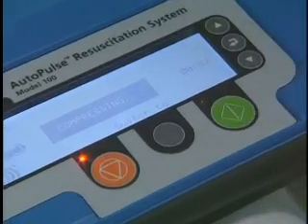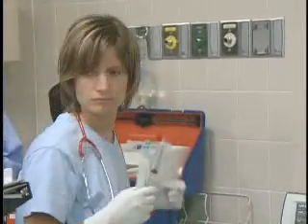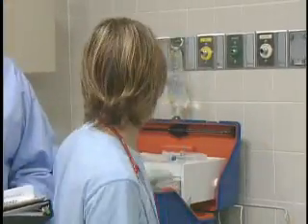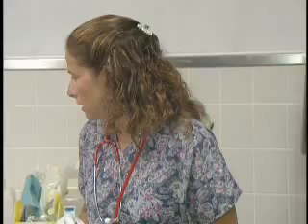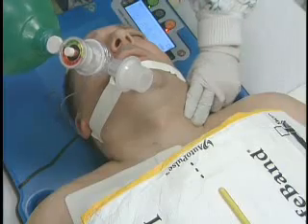Let's get another milligram of epinephrine ready, and we'll have some atropine — one milligram of atropine and one milligram of epinephrine. Let's circulate that in. We have capnography and a pulse with the auto pulse going. Pause the auto pulse, let's see what the underlying rhythm is. It looks like we're back in V-fib.